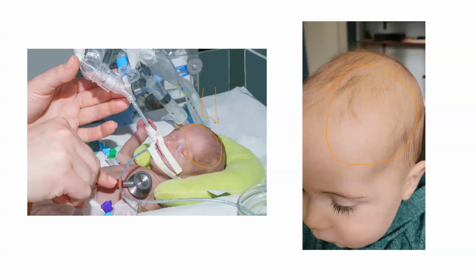this is the probe. Now, if it's emitting high frequency waves which are interacting with the brain, the wavelength between these sound waves is less. So they are basically interacting with tissue in very short distances.